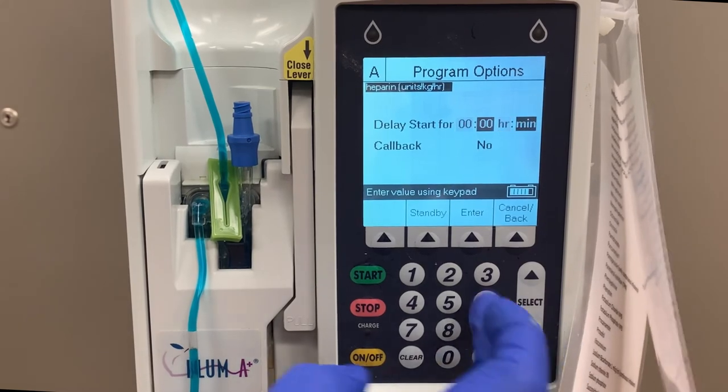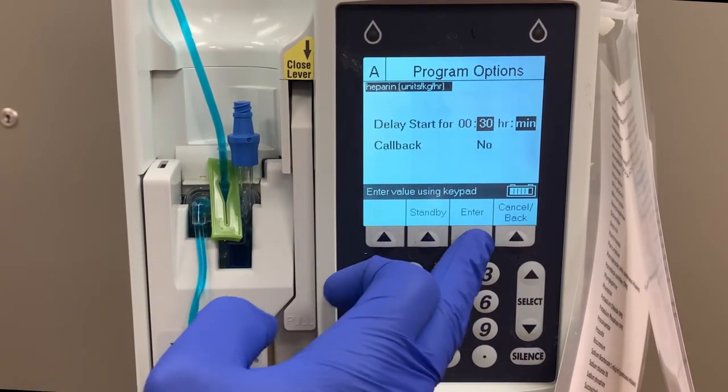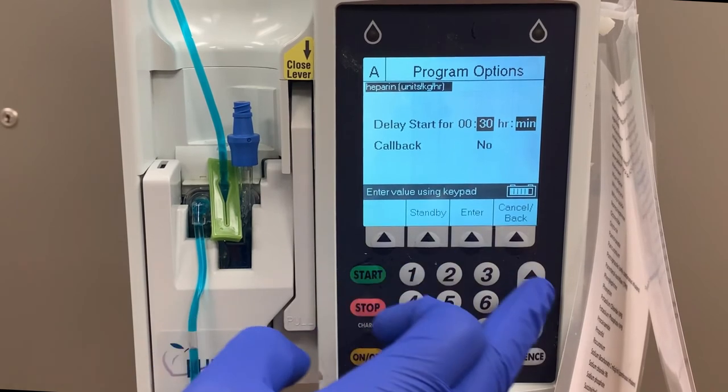This will show you a Delayed Start. Identify the amount of time you need to delay the medication and press Enter. You also have the option to set a callback alarm. This will cause the pump to alarm when the medication is restarted.